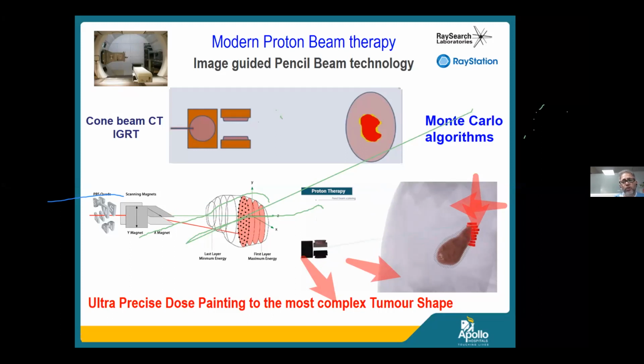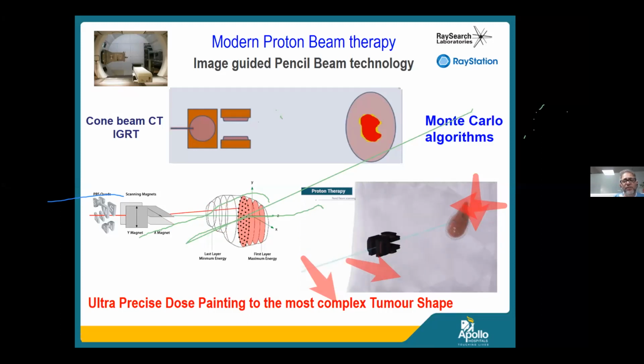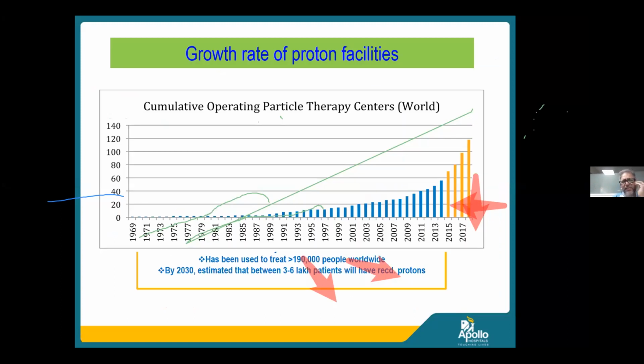So most of the people use calculation, and we have treated now almost 200 odd patients, but we have insisted that every single patient is treated with or optimized by Monte Carlo optimization. It takes a little bit more time. This is mainly for my radiation oncology colleagues to emphasize how important it is to put all these processes in place, such that you can achieve the best the technology can offer, and ultimately, of course, help the treatment plans and help our families.